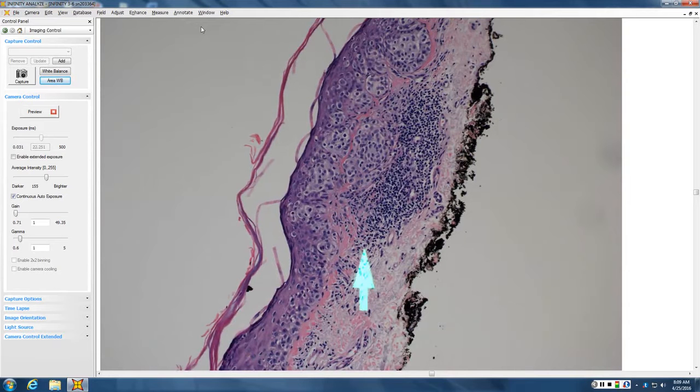The red flat bottom fibrosis goes with melanoma in situ. It pushes the elastosis and all the elastic fibers down, bulldozing them away. The invasive melanoma is typically included within that bulldozing stroma. So if there's ever a question of whether that dermal component is melanoma or not, you can do an elastic stain, because in invasive melanoma the elastic fibers are bulldozed away. In most nevi, they're retained.